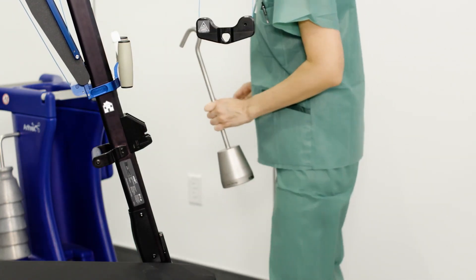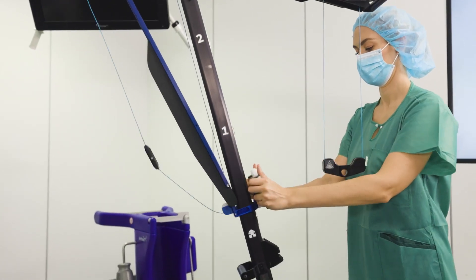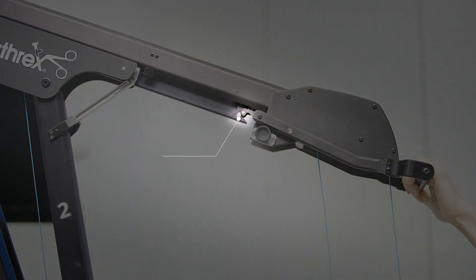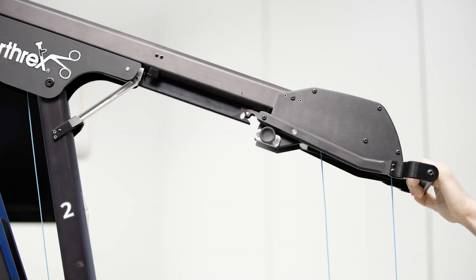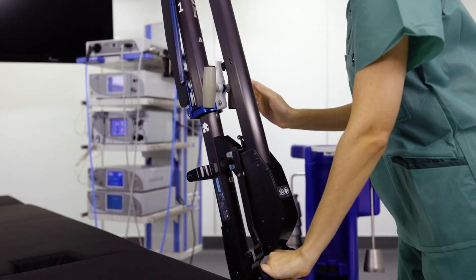After removing the weights and weight hanger, fold the tower for removal and storage by returning it to the home position and pulling down on the blue handle to release the locking mechanism. While supporting the boom, slide the upper boom straight back and then pull down to collapse it into a vertical structure.